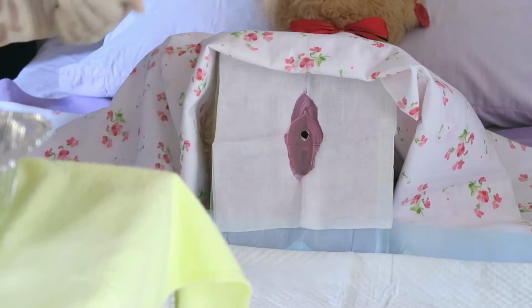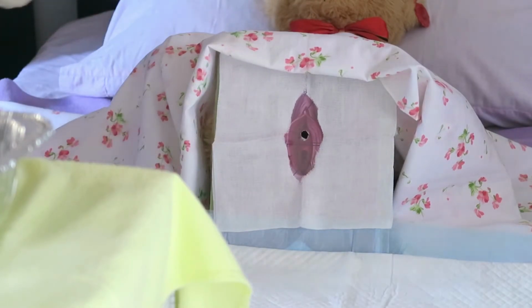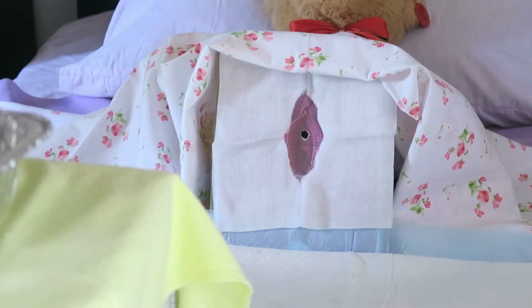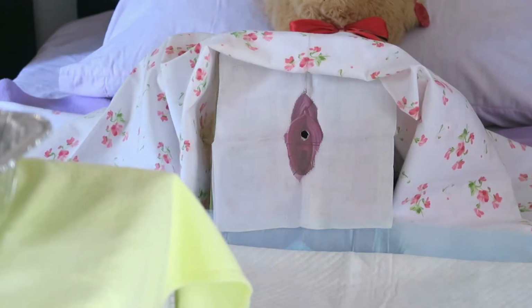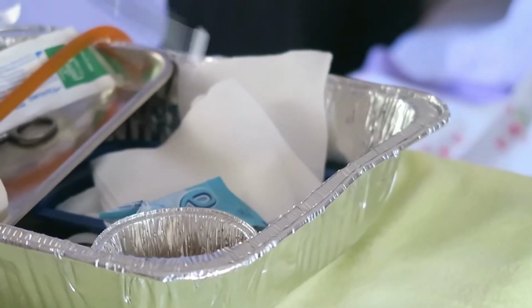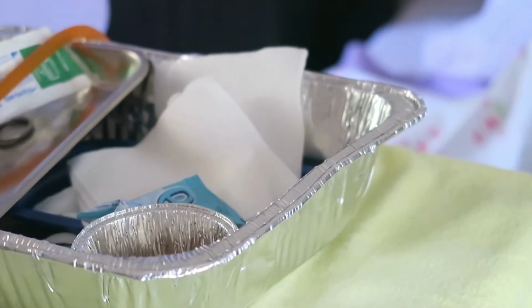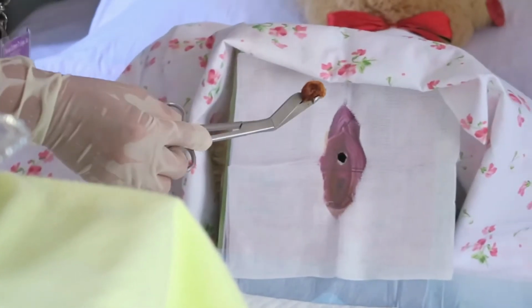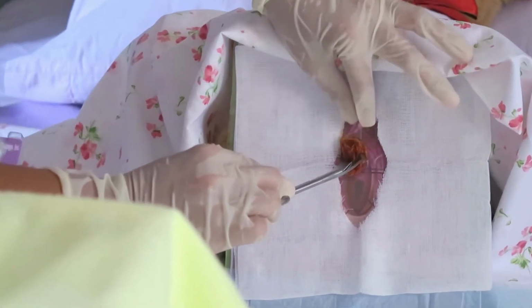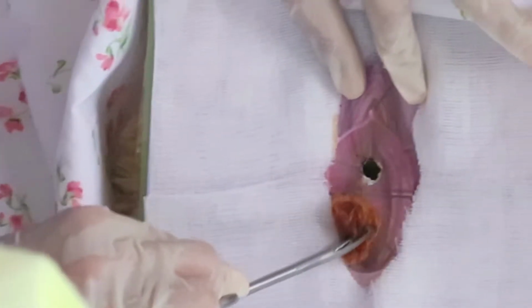Then after you put the eye sheet, get cotton ball soap in a cleansing solution. Then clean the genital area of the patient. So ma'am, I will clean your genital area po, ha. Then discard.